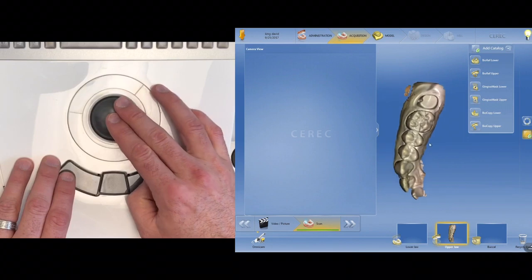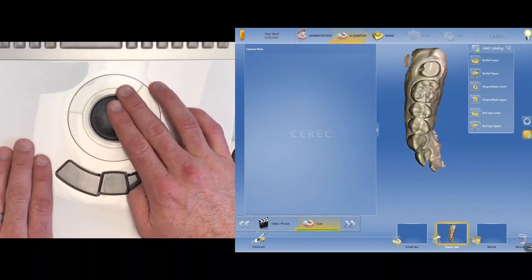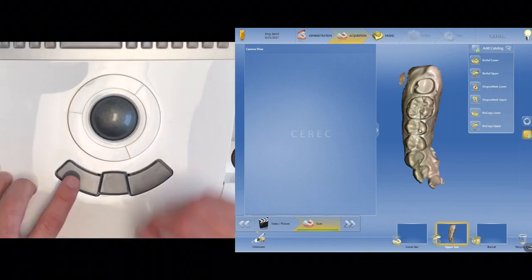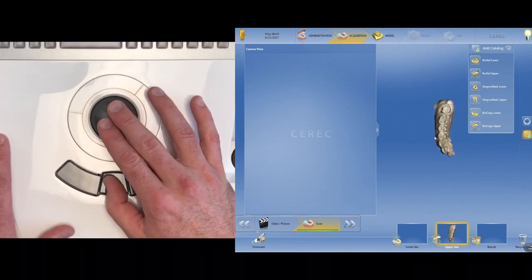But you can see how I'm using my thumb to get both of these buttons. Some people do it like this with their ring finger or their middle finger and their first finger on their left hand. This is how I've developed the most comfort. I just use one finger for my left hand, and then my right hand does all the ball movement here, the panning and the zooming.